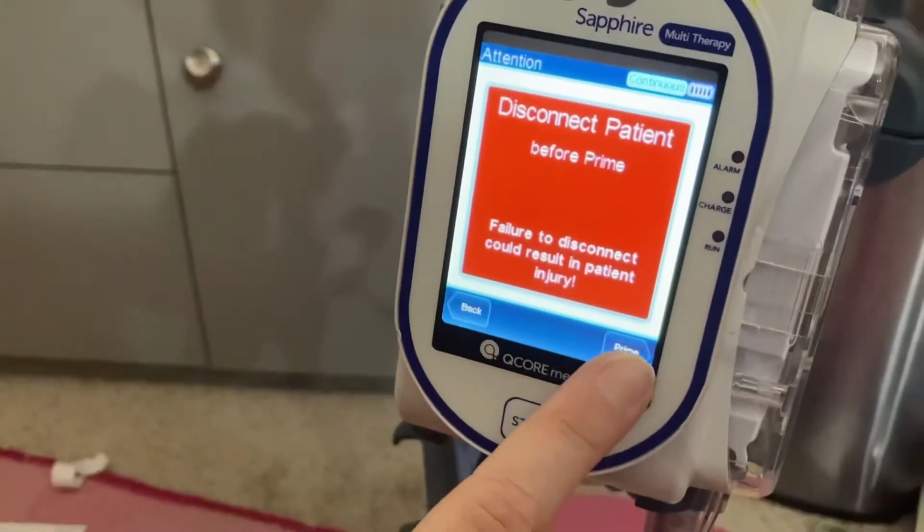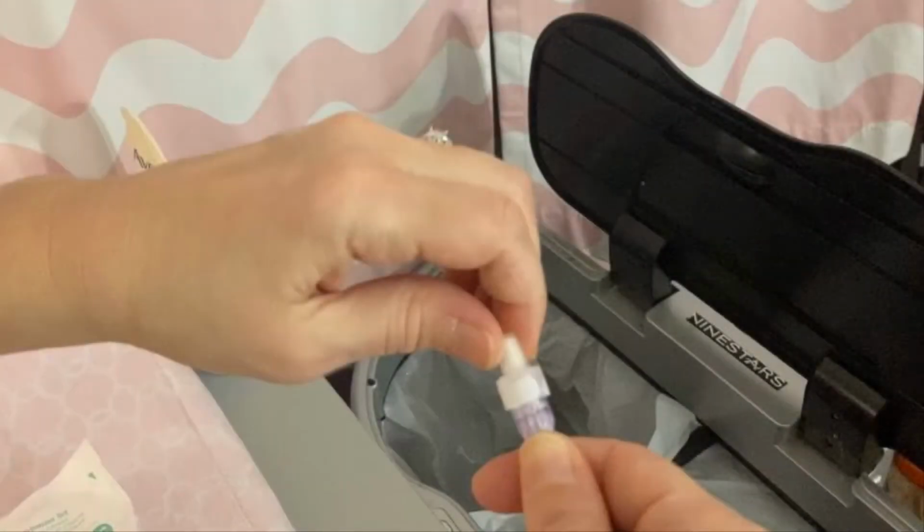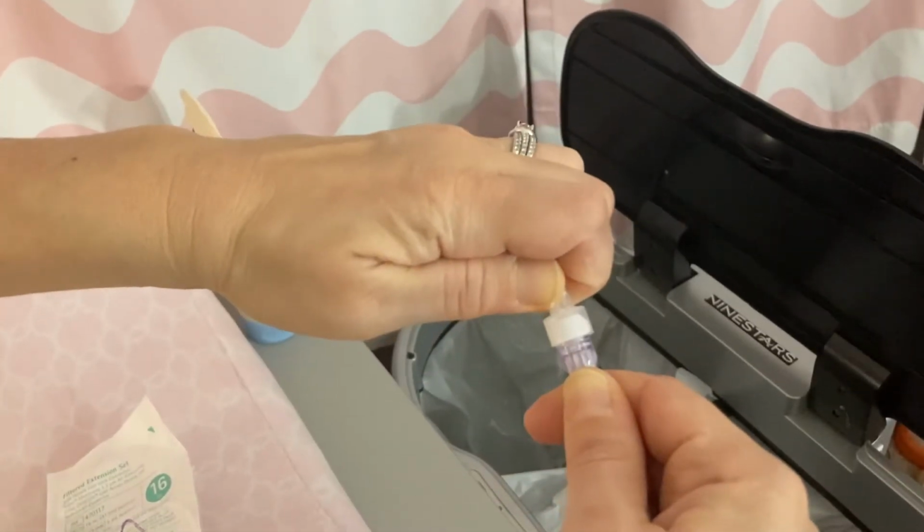It will automatically prime the lipids through the line for 50 seconds. You must loosen the cap at the end of the tubing as air is being primed out. Just a little twist is enough. You don't want the cap to come off. You can tighten when it is done.